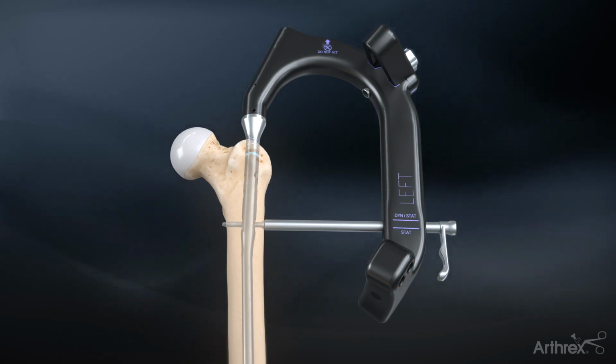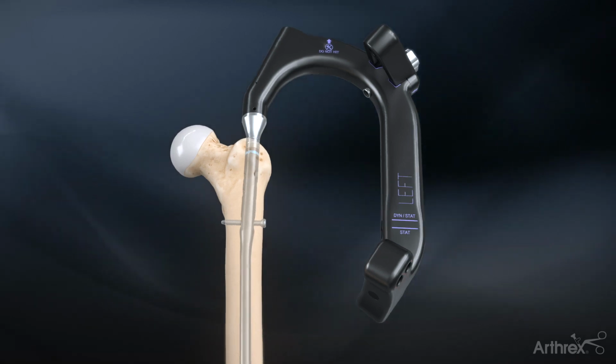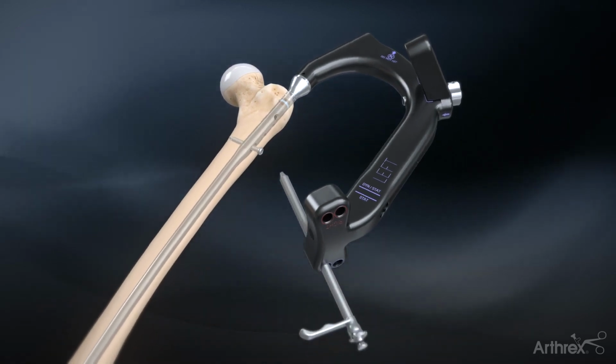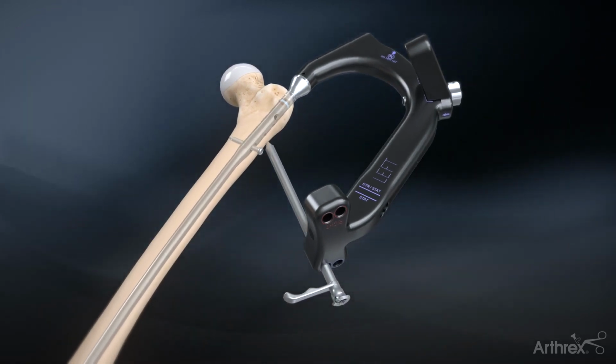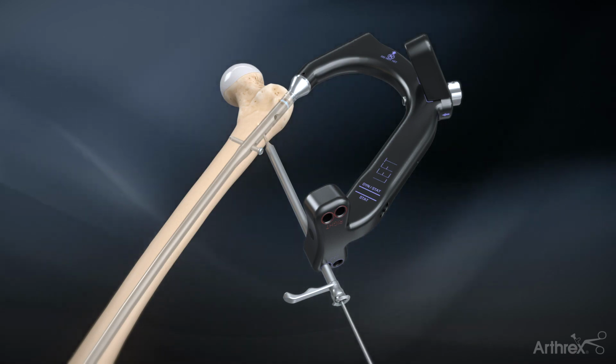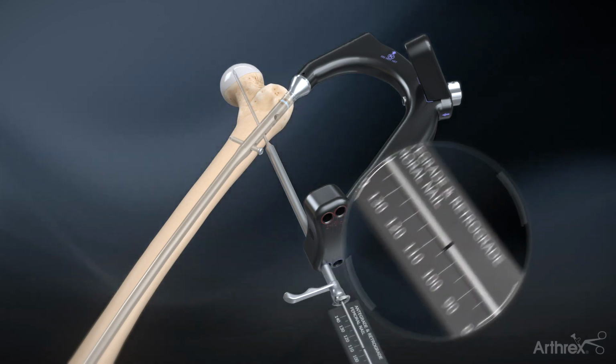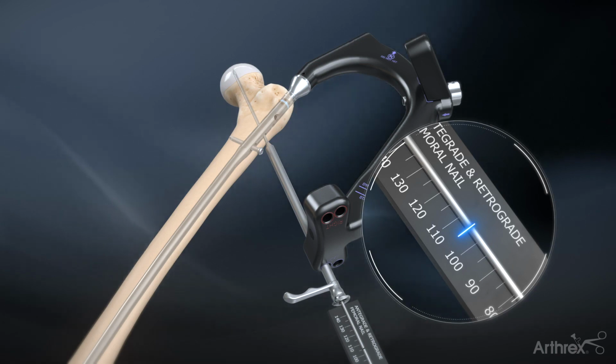The sheath is removed and the reassembled screw sheath, pin guide, and obturator assembly is slid through the distal hole on the targeting guide. Remove the obturator and insert the 3.2 mm guide pin through the guide and into the femoral head. Use the laser marking on the guide pin by sliding the guide pin depth gauge over the guide pin and reading the required screw length.